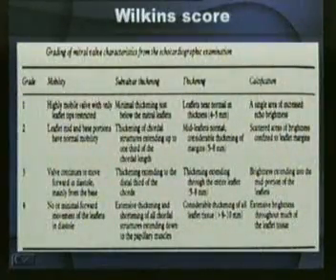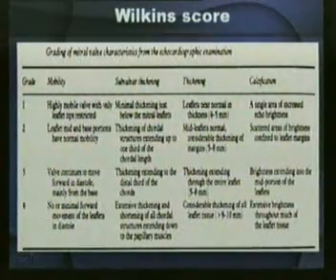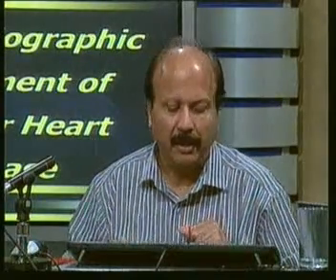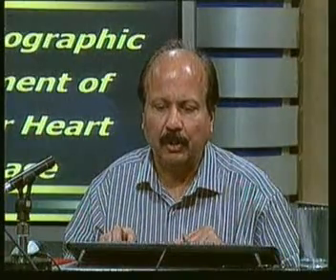So these are things which you need to know, you need to look at. But once you have done 100 patients with mitral stenosis, keeping this in mind, you will be able to tell your interventional colleague whether he can or he cannot go ahead with the balloon mitral valvotomy. And this is what we do in our institution.